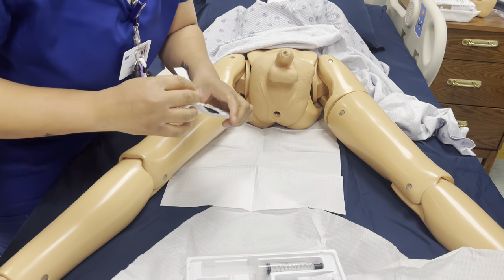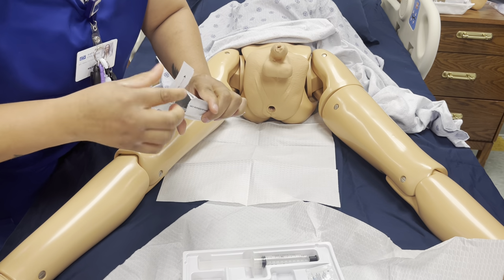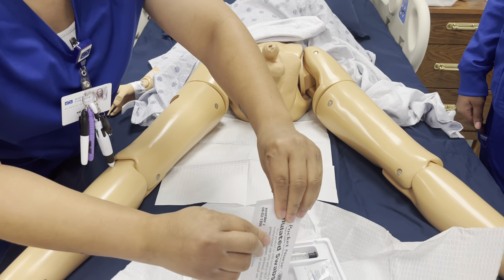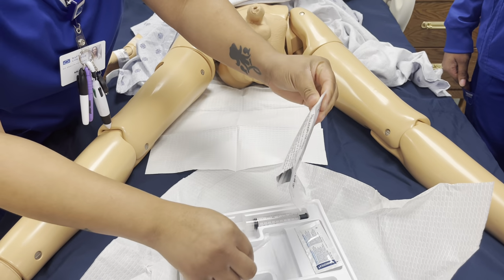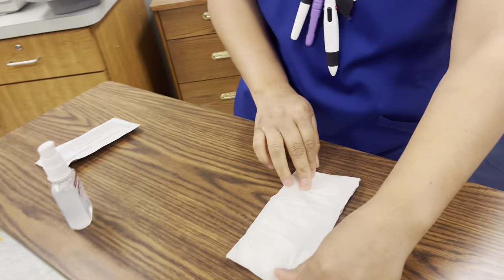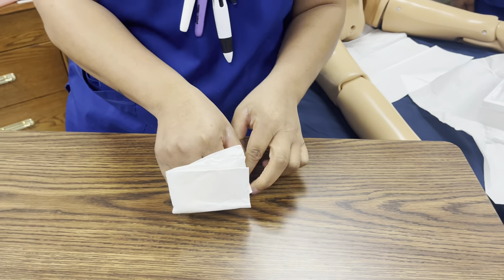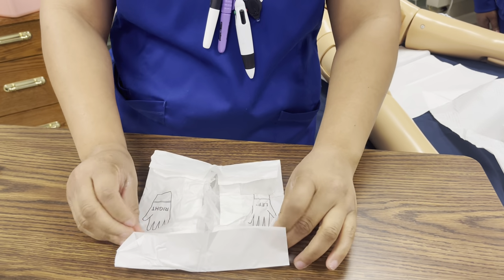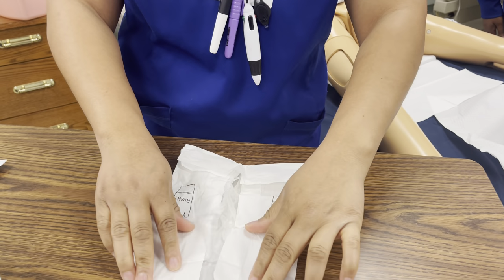Now I'm going to discard. It's our first time doing this, y'all, so we're learning as we go. And as she went, she discarded them. Now we're going to open away from the body. Open my sterile gloves, pull it out, and don't break sterilization.